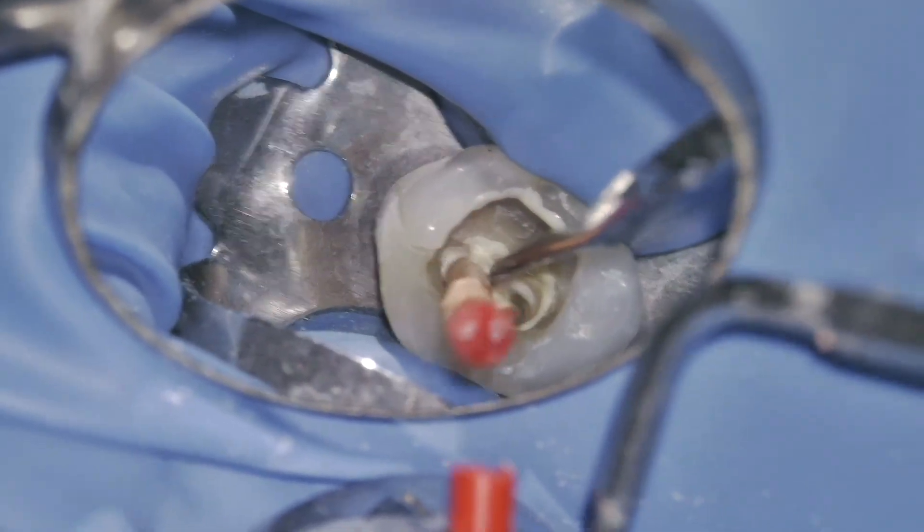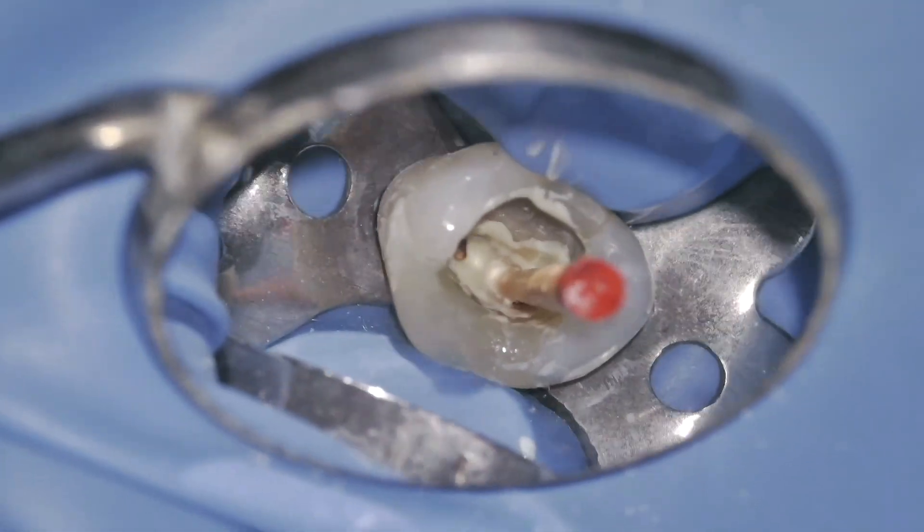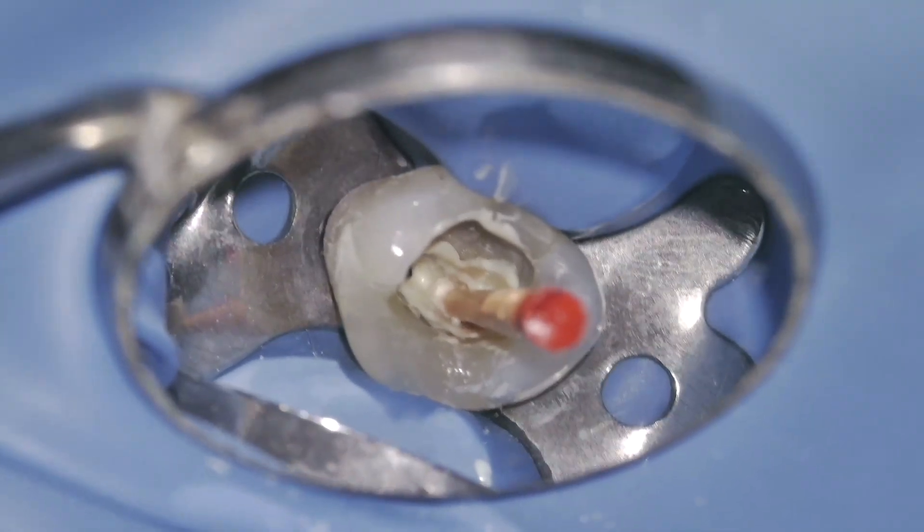This ensures the apical and lateral areas are well sealed. I apply heat to soften the gutta-percha, compacting it vertically to fill the canal completely.